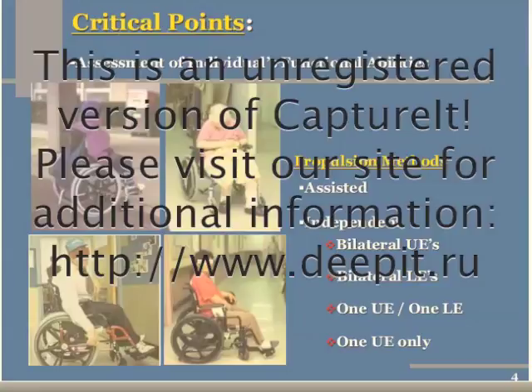Just remember that it is so important to have the individual try the one-arm drive wheelchair before it is ordered. It goes back to my question from the seating material in Module 1. Who among you would buy a car without test driving it first? This is a specialty feature, and unless the person has known experience with it, they need to be able to try it.